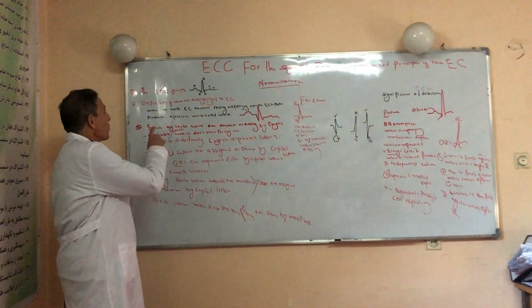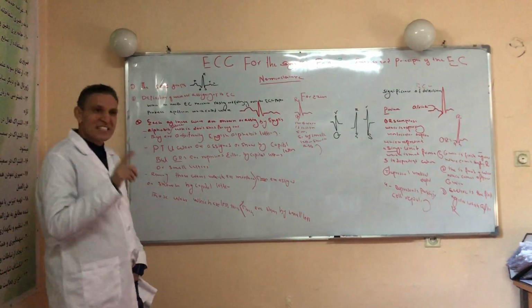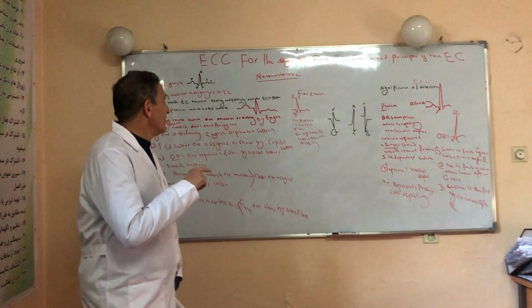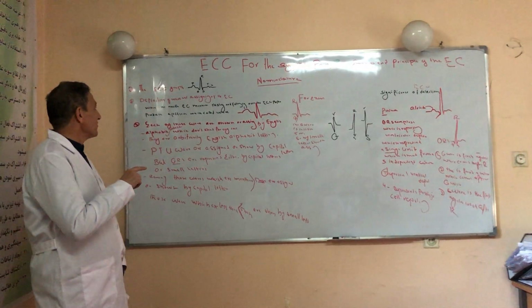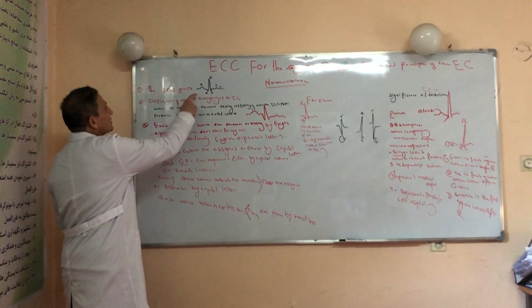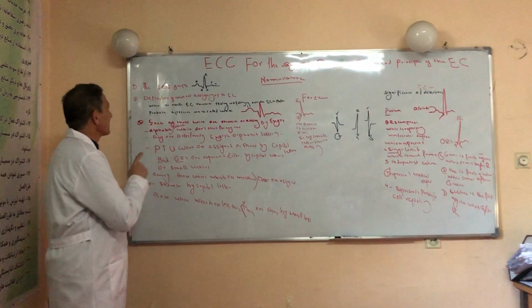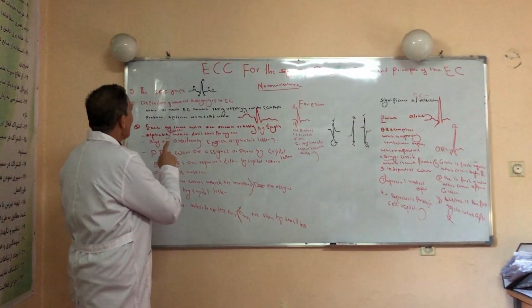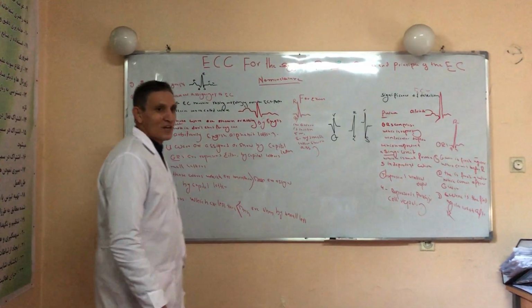The ECG graph is defined as a series of the waves or deflections which are seen in one cardiac cycle.